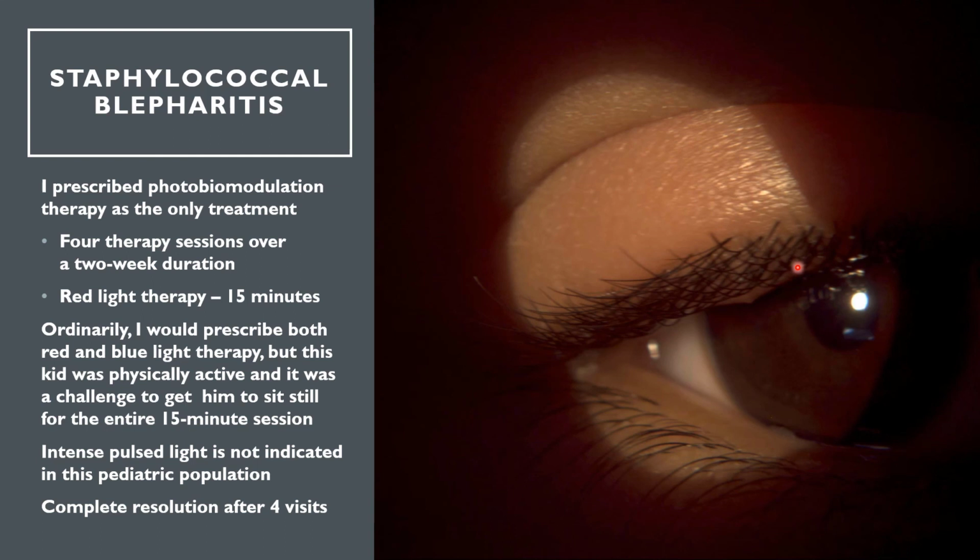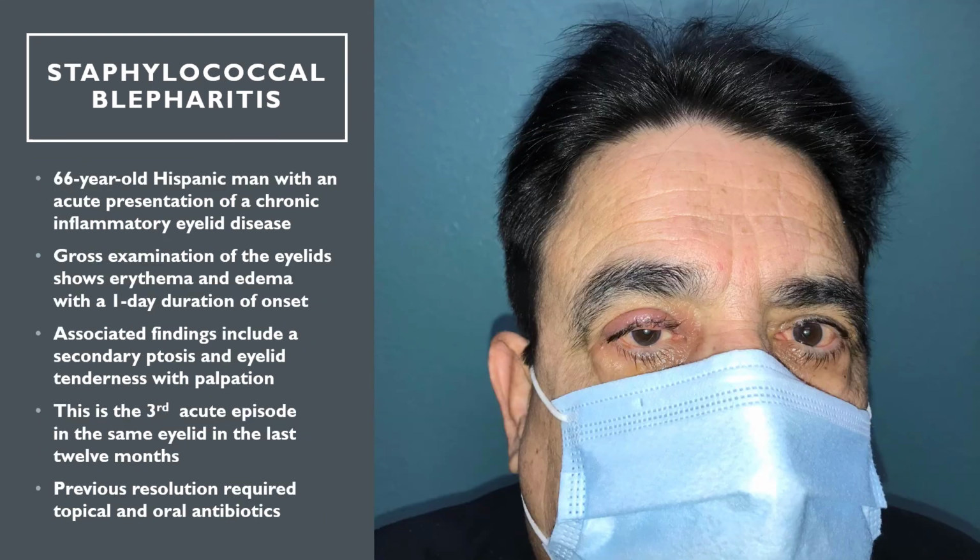But I told you 5 times, this kid was out of control. I was almost like, hey, take this kid out of here. He bothered me. But I wanted to help him, and I wanted to see if this stuff would work on it. And of course, the answer is yes. Okay, so I did him 4 times, and he got better. And again, to me, I just don't use IPL on this stuff. It's on the eyelid. It's too close. I don't want to do IPL on kids. This is a photobiomodulation thing.